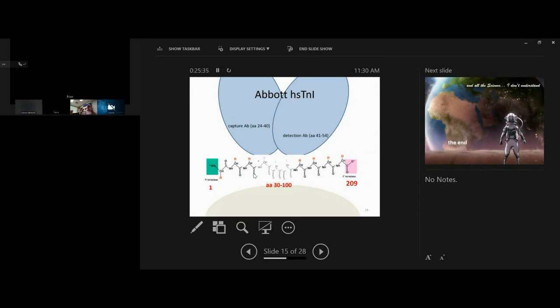Now, I mentioned earlier that this whole macrotroponin thing really only seemed to start when we got high sensitivity troponin assays in the labs. As you know, the whole point of these assays is to be better at detecting low levels of troponin and presumably detecting all those different forms of troponin that we want to detect. But maybe something else has happened. Maybe they're also detecting the form that we don't want to detect, the macrotroponin. Maybe whatever the manufacturers have done to tweak their assays has meant that the binding of the antibody in the assay to the troponin molecule is so strong that it can kick off, I'm flicking that big antibody at the bottom of the screen, to kick off the patient's own anti-troponin antibody, and bingo, you've got rid of the macrotroponin in the sample, and now it just looks like regular troponin.